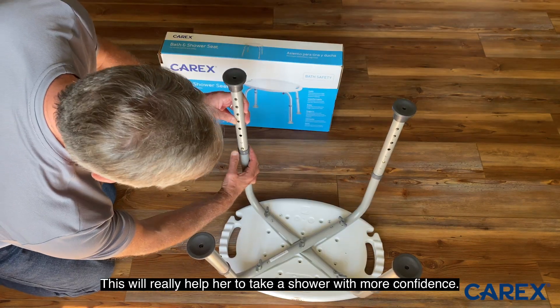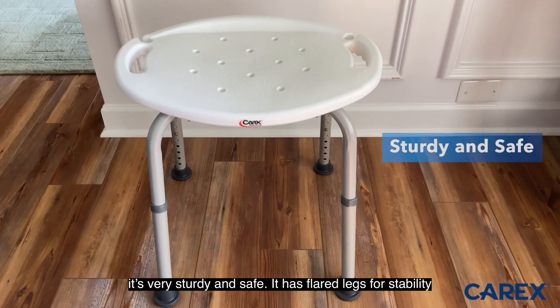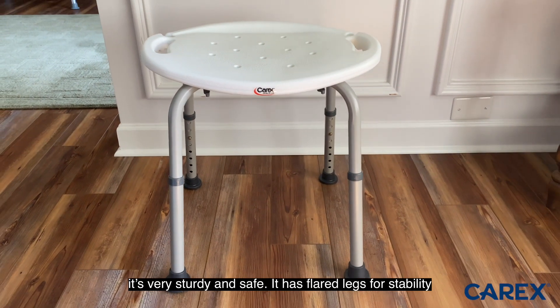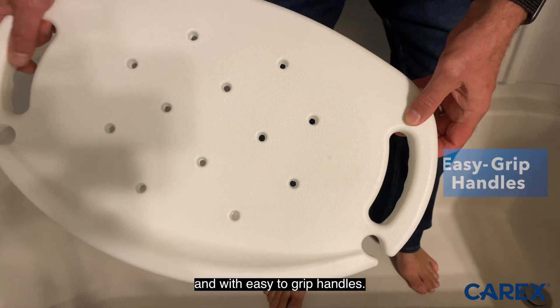This will really help her to take a shower with more confidence. It's very sturdy and safe. It has flared legs for stability and it's made with durable plastic and with easy-to-grip handles.